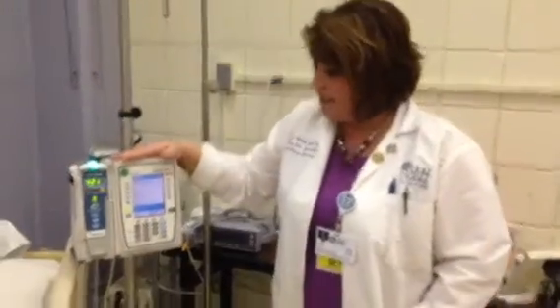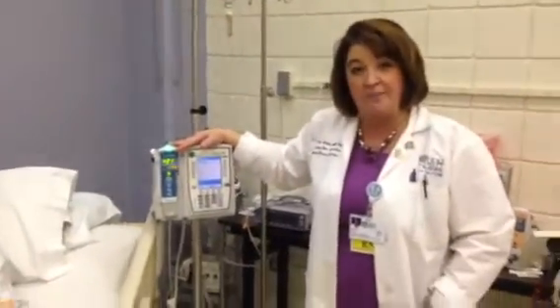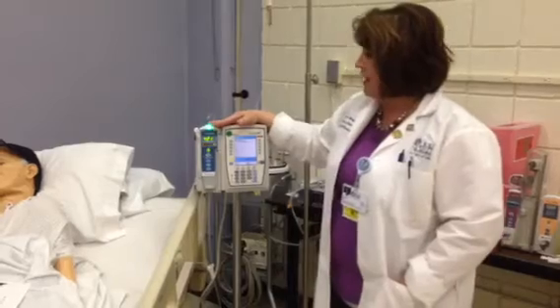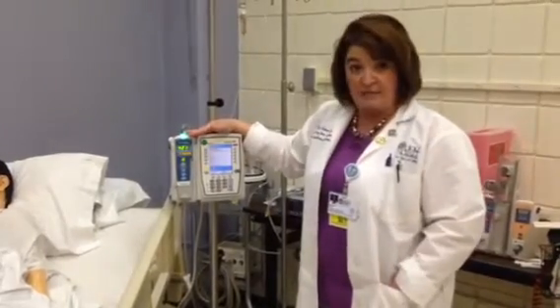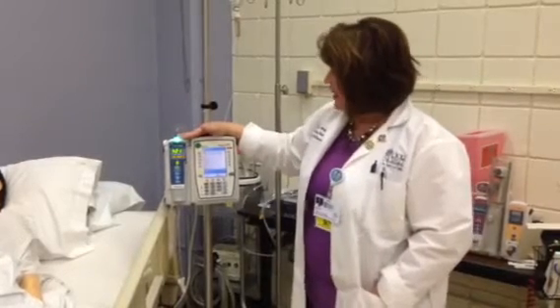I like to stand here with the patient with my hand on the pump so that I am conscious and aware of when that bolus has been completed. I can talk to my patient, I can inform the family of what is going on and what to expect from now on. We might be doing some more assessment points, but mostly I am paying attention to this infusion to make sure that it is going in properly and he is receiving that bolus.